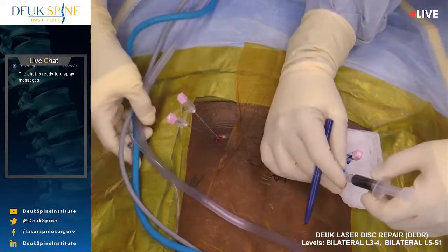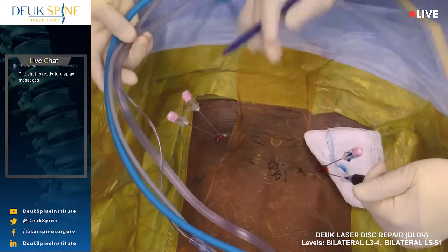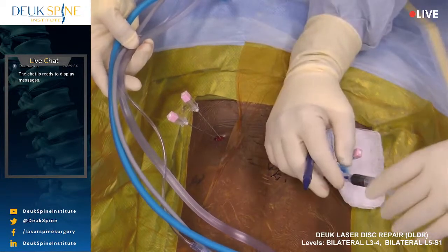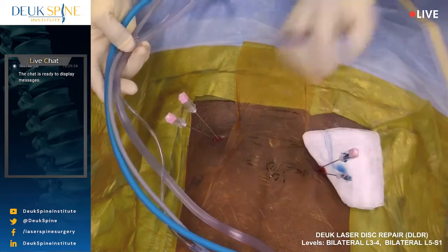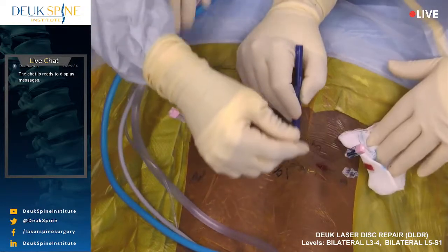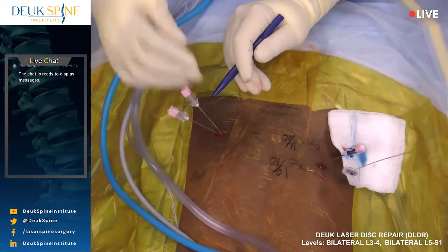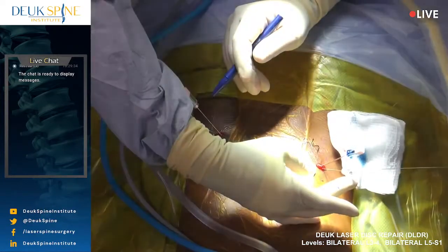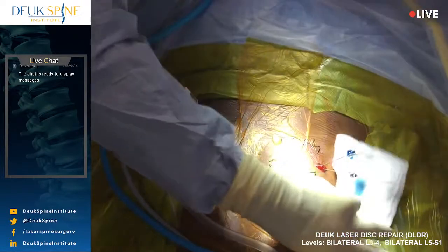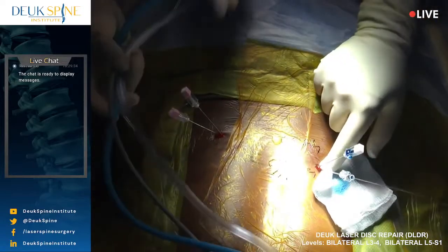All right. How bad is that on a scale of 1 to 10? Huh? 11? All right. You get to go to sleep. When you wake up, we'll be done with your surgery. That was an 11 out of 10. Is that where you typically get your pain? All right. Congratulations. We found the 2 painful discs, and we're going to unpinch your nerves so you can get strength back in your legs. I want you to count from 1 to 100 out loud, sir.